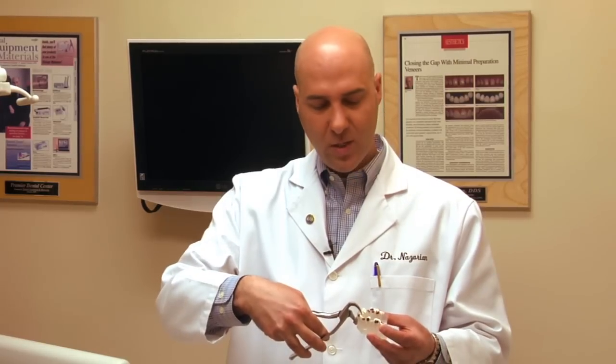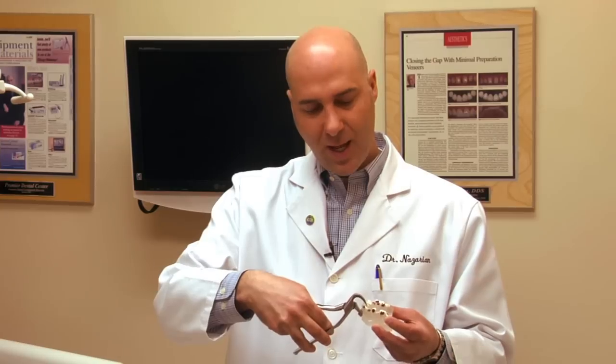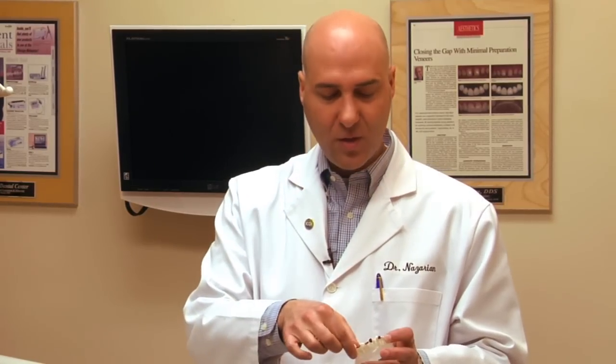A lot of dentists have a tendency to want to squeeze. We don't want to squeeze, otherwise you will crack the buccal plate of bone. What you want to do is engage that tooth and then use a lever action and put some pressure on it. And what I found in my practice when I utilized this instrument is after about 20 seconds of putting force on this, the periodontal ligament is separated, and then all of a sudden the tooth will loosen up, and that's when we either take a cotton forceps, or take our fingers with gauze and pull the tooth out. It's as simple as that.